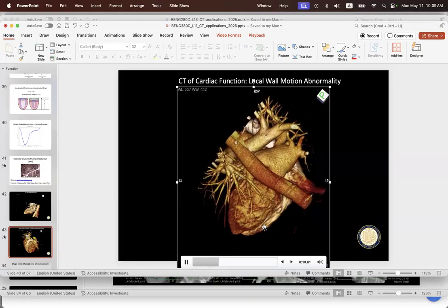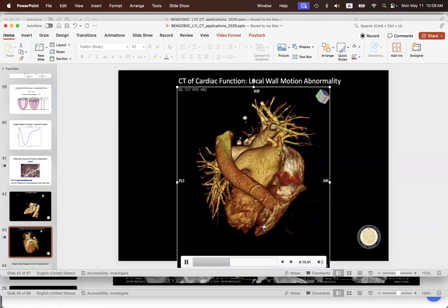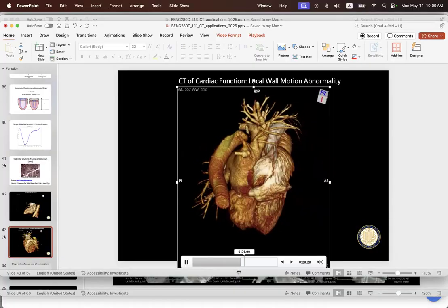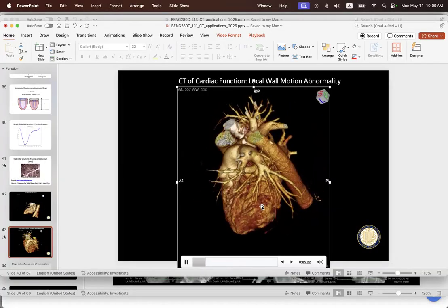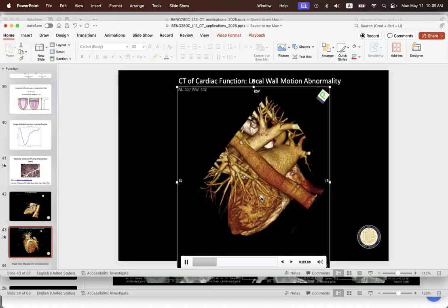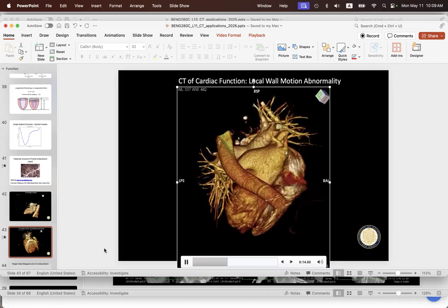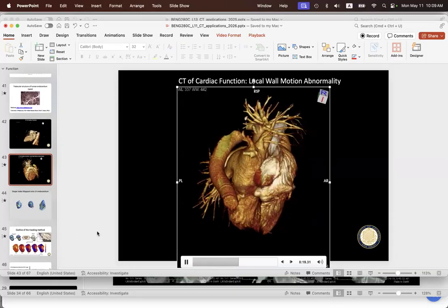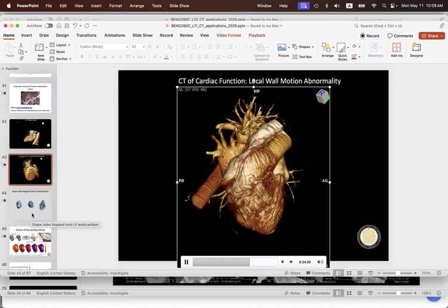It's a pocket of blood in the left ventricle that is filling up a distended hole in the side of the left ventricular wall. It's not a leaking hole, it's just a pit. And so that blood is not moving. And so you can just draw around that very precisely where that infarct is and where that function is not occurring, just by looking at the 3D movie. Hard to do on 2D because of the different angles. You certainly could see that abnormality though.